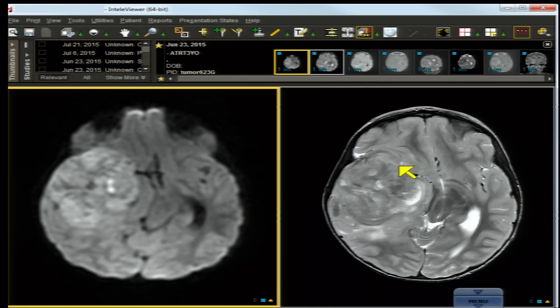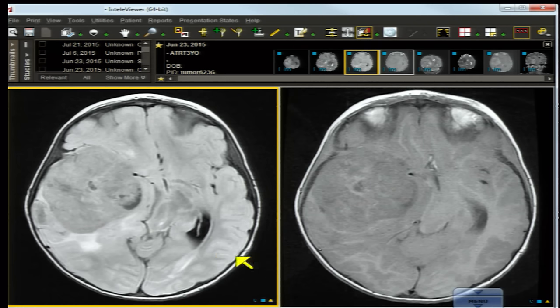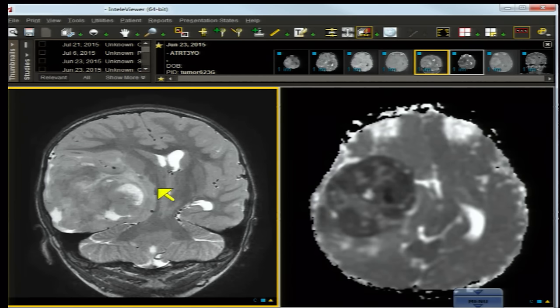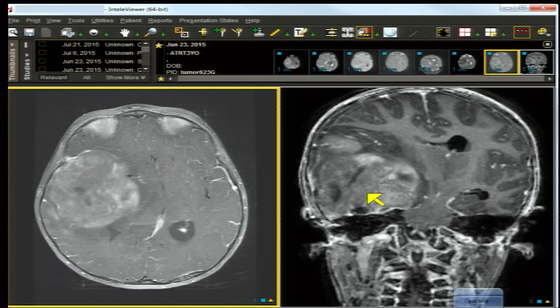The axial T2 shows a heterogeneous mass. You'll have to decide if it's intra- or extra-axial over the course of these images, and whether it's intra- or extra-ventricular. There are some foci of high signal within the axial FLAIR image, an axial T1, a coronal T2, an axial ADC parametric map, an axial contrast-enhanced T1, and a coronal inversion recovery contrast-enhanced T1.